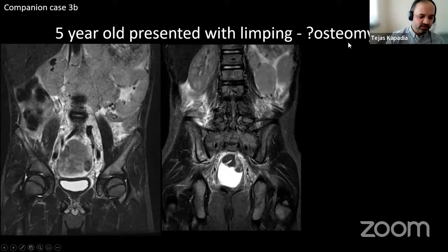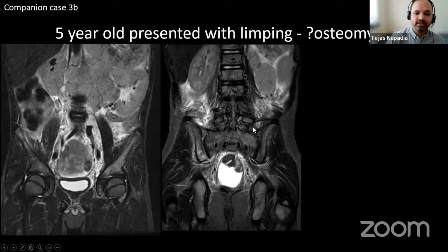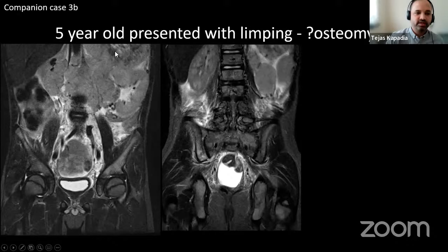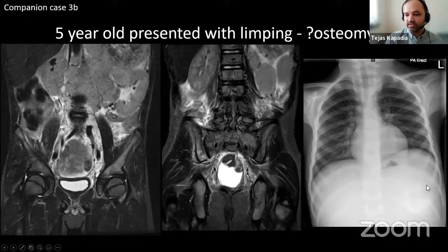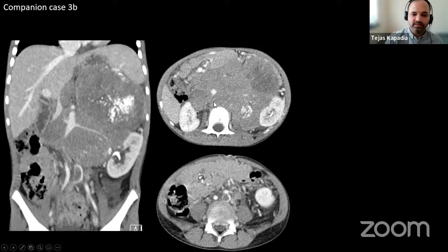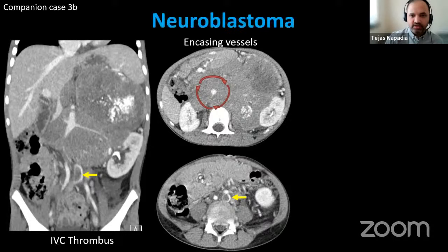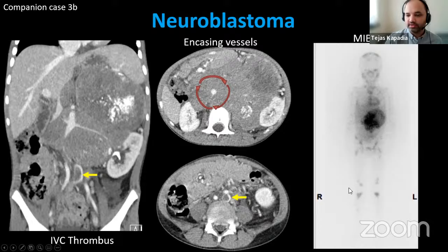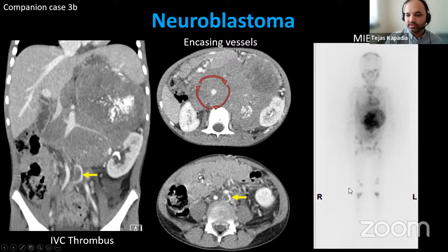Another companion case: a five-year-old presenting with limping, referred as query osteomyelitis. Lumbar spine and pelvis MRI showed extensive lesions. What was missed was soft tissue in the upper abdomen. Reviewing the chest X-ray showed extensive areas of calcification in the left upper abdomen. CT abdomen found a huge mass encasing vessels and pushing them anteriorly, with an associated thrombus. MIBG confirmed extensive disease in the abdomen and bones — a classic neuroblastoma case, illustrating various presentations.